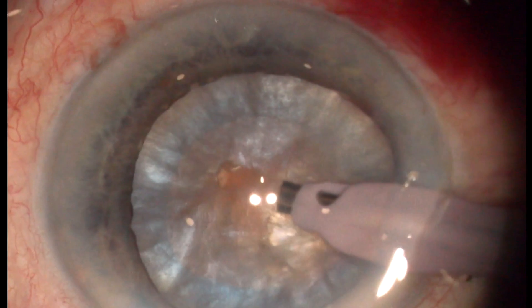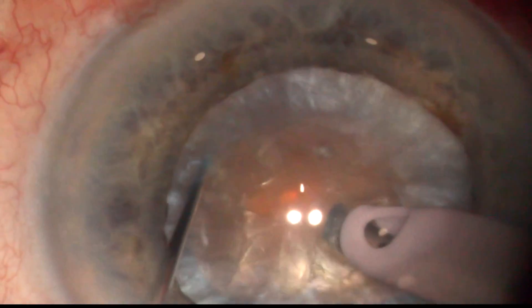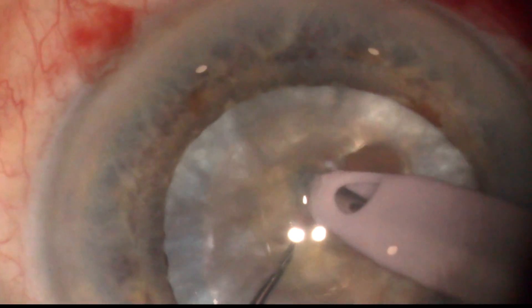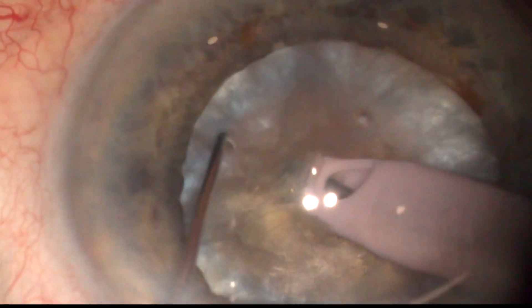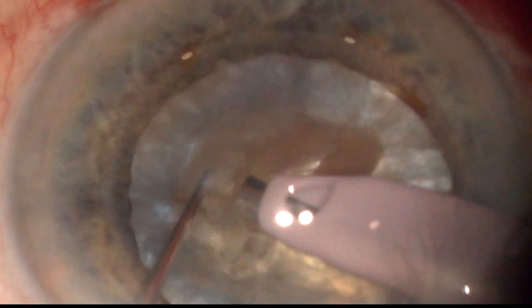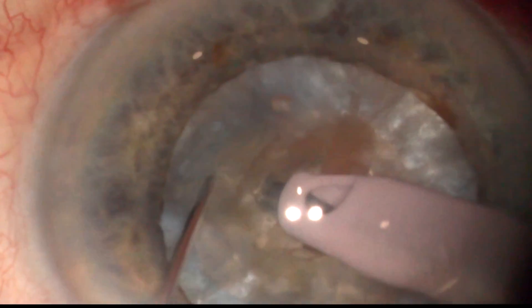Microchop is a technique specifically designed for hard cataracts with a leathery posterior plate. Microchops are low-intensity chops — we don't try to break the posterior plate, and this results in a reduced movement amplitude. With other techniques, wide movement amplitude is necessary to break the elastic posterior plate.